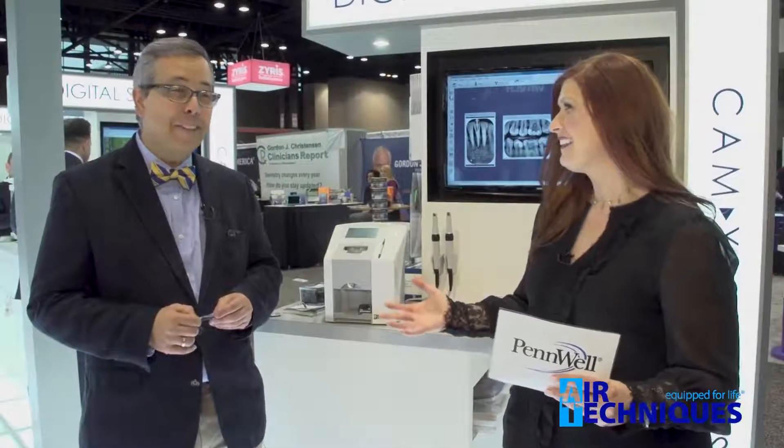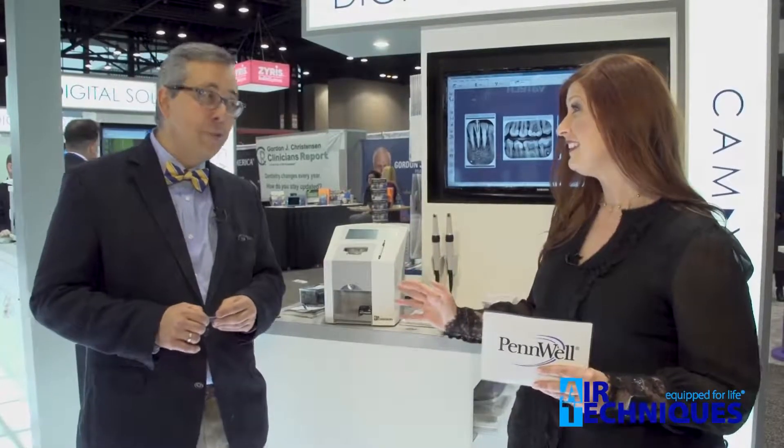And now I'm with Dr. Yepes. Thank you for chatting with me. Love to be here. You're a pediatric dentist. Yes, I am. And you are currently using the original version of the ScanX. Yes, I am a happy user. So what do you think about the new ScanX Swift?